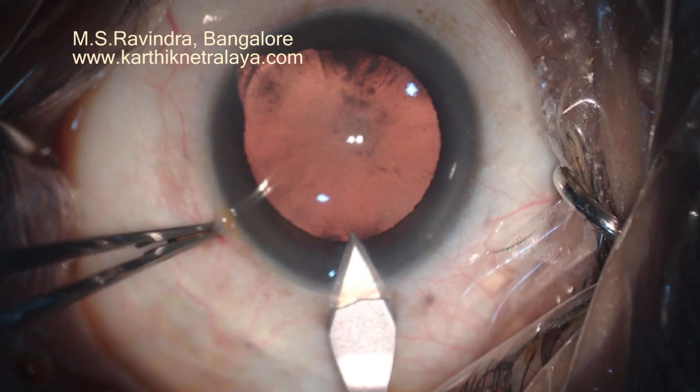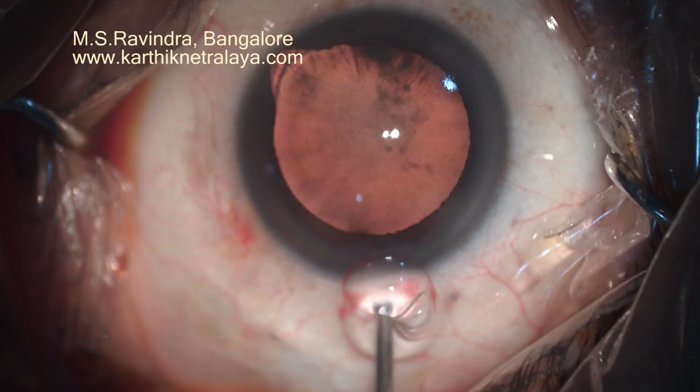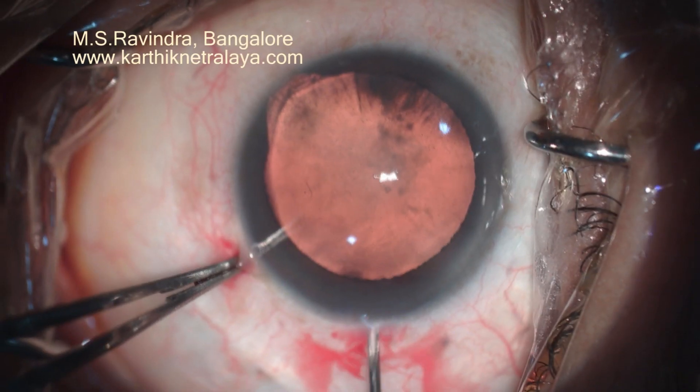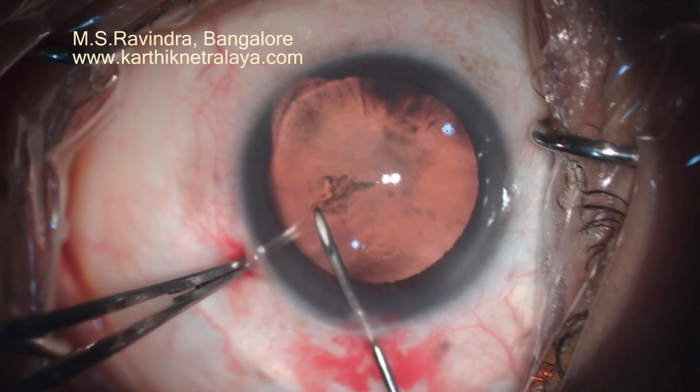Entry at the steep axis. Translimbal direct entry into the anterior chamber with a 2.8 mm keratome. HPMC is injected into the anterior chamber. The cystitome enters the anterior chamber, perforating the floor of the tunnel at the limbus.